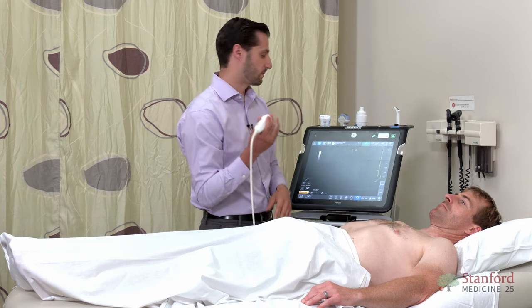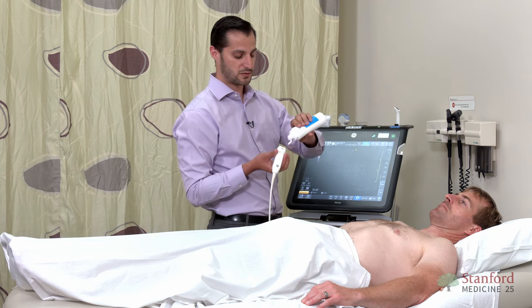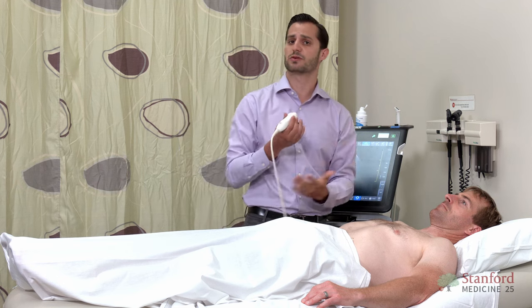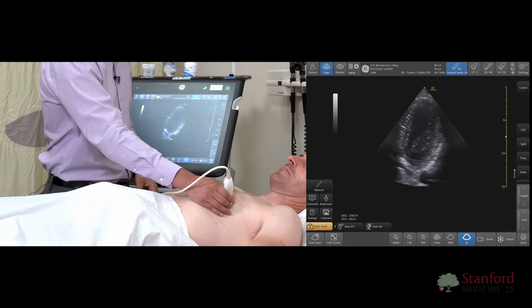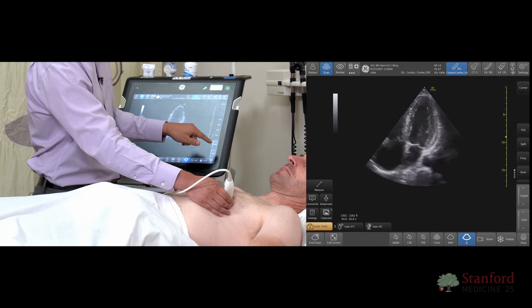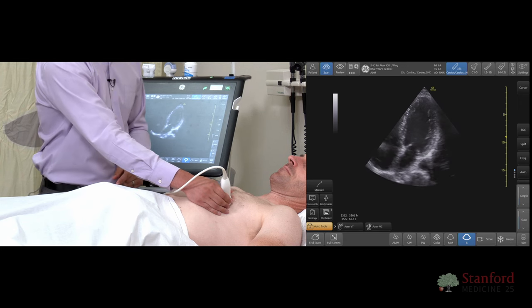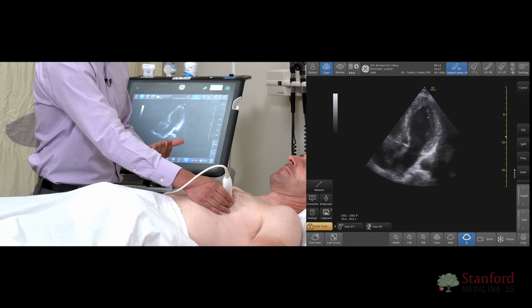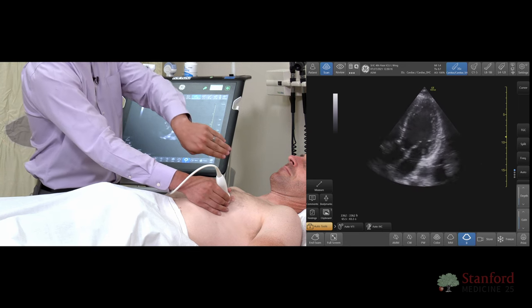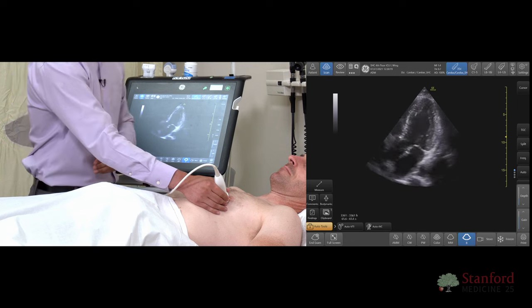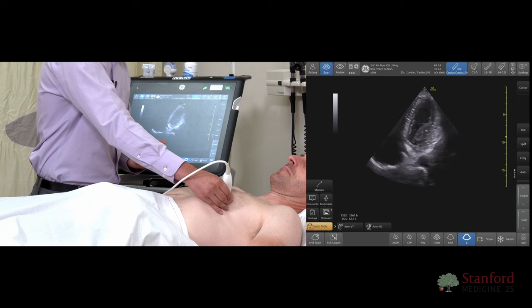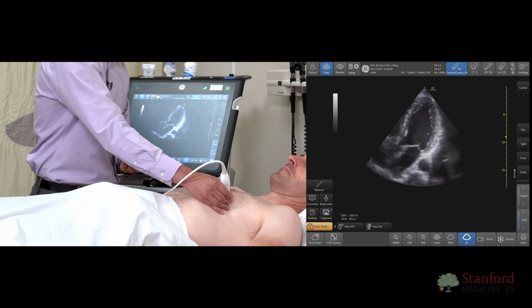Thinking about the apical four-chamber, this can be a challenging view. In addition to having the patient turn onto their left side — which is something you'll commonly need to do — you also want to think about your depth and adjust it to an appropriate level. Another thing is that patients often end up with an apical five-chamber view, meaning the probe is pointing more towards the patient's head or more anteriorly, which may give you a foreshortened view of the heart. Try to make the probe as perpendicular as possible to the patient's chest wall.